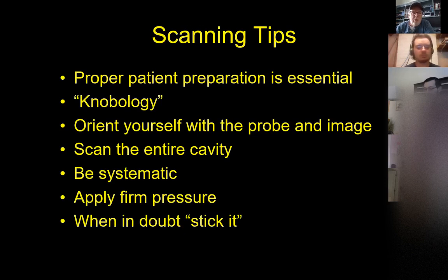Okay. When people do echoes, the echoes are usually done by the cardiologists, which are internal medicine folks, and they do most of the echoes, and they have to flip the dog around. So when you're looking at echoes, heads to the right. The rest of the imaging world does it with the head to the left. Why they had to flip it the wrong way, I don't know, but they do. So in general, head is always to the left, just like it is with x-rays.